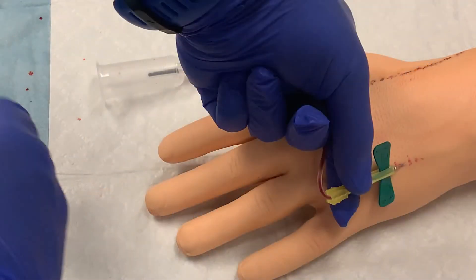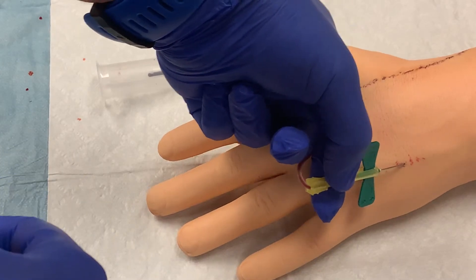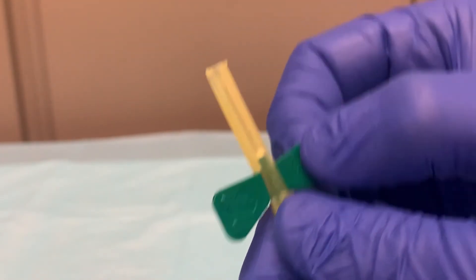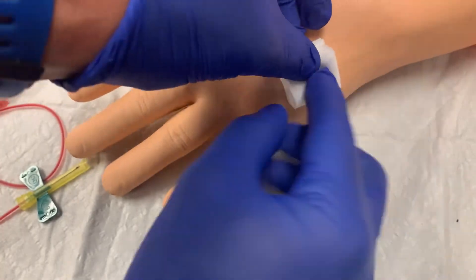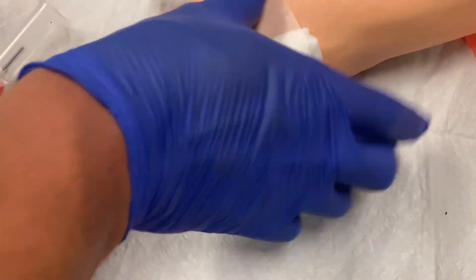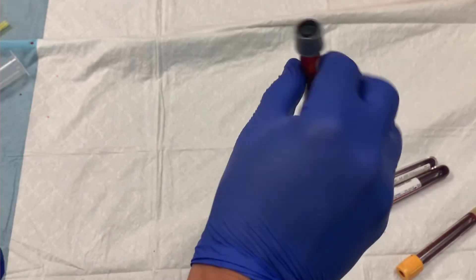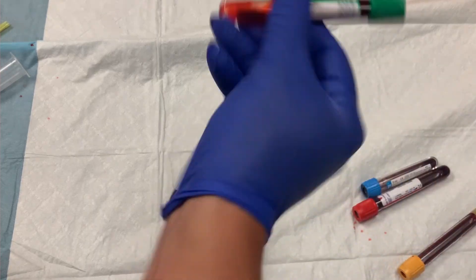When all tubes have been filled, it is time to remove the needle. After removing the final tube from the adapter end of the butterfly, gently pull back on the needle until it has exited the patient's skin. Then immediately engage the safety lock by sliding the yellow hub over the needle. Hold 2x2 gauze over the site with steady pressure to minimize any hematoma formation, and then fold some 2x2s and tape them over the site to create a pressure dressing. Dispose of the butterfly needle in the sharps container. Next, return to your tubes and invert each tube multiple times to fully mix the preservative with the blood sample. Do not shake the tubes — just invert them back and forth smoothly.